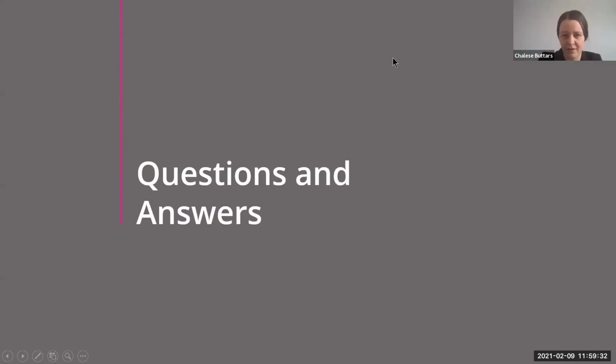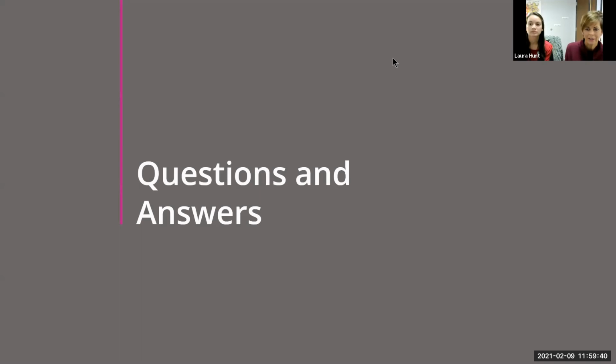Joyce, let me see if there are any questions here in the chat box. David, did you notice any questions that we need to address in the chat box? So one of them says, it sounds like the More technology is not available in the Exceed 2 hearing aid. That is correct.